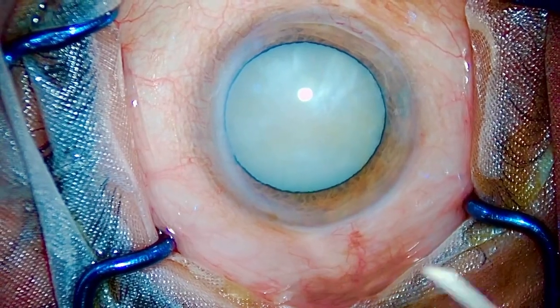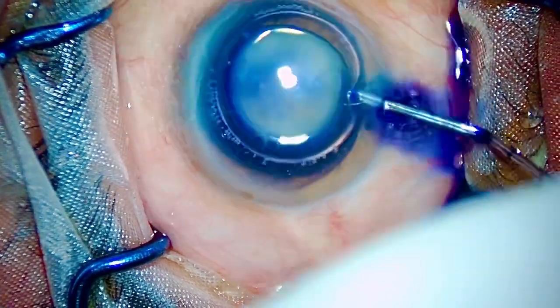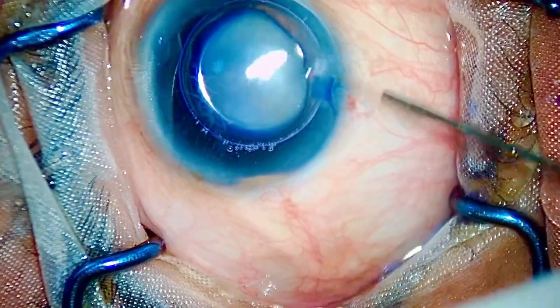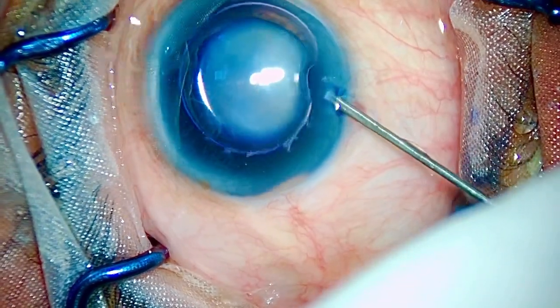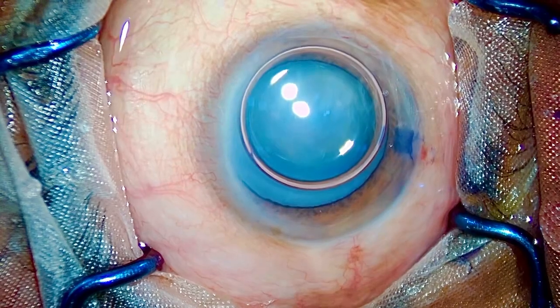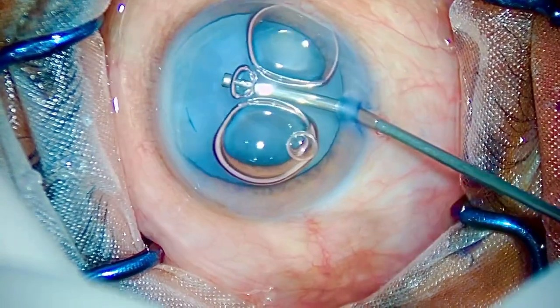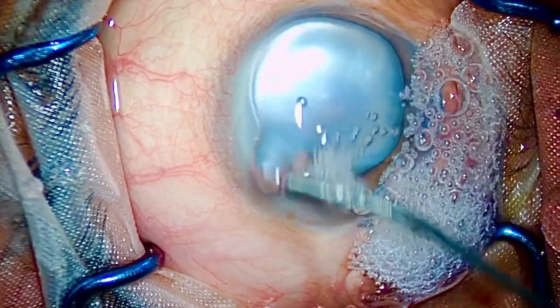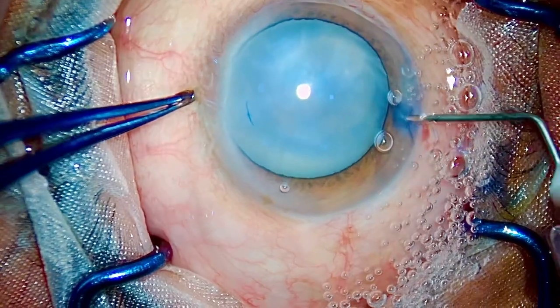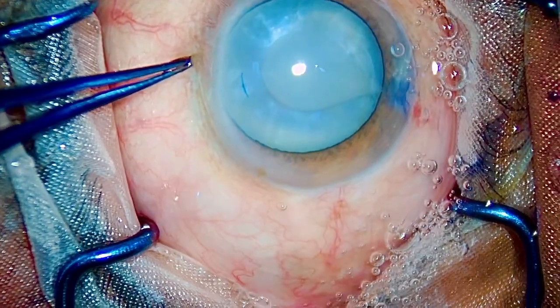As you all must be knowing, there was a technology called Zepto-Rexes which used electrical currents to burn the anterior capsule and make a perfectly circular Rexes. Back in the days it was a fancy technology. The technology has been superseded by Femto lasers. If you compare a manual CCC with a Zepto or Femto, the manual CCC margins under an electron microscope are much stronger than laser Rexes, offering greater long-term strength, though Femto offers more control to the surgeon.